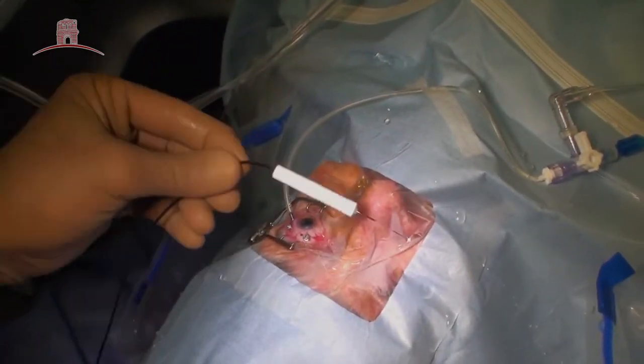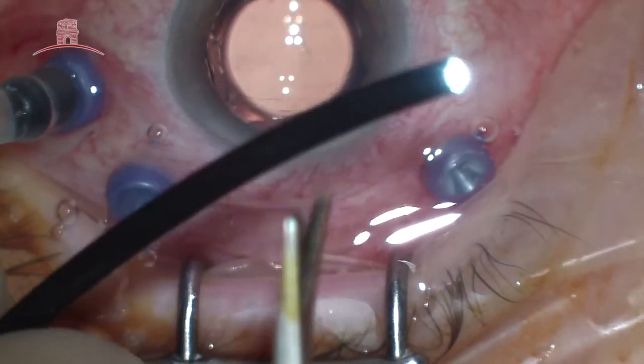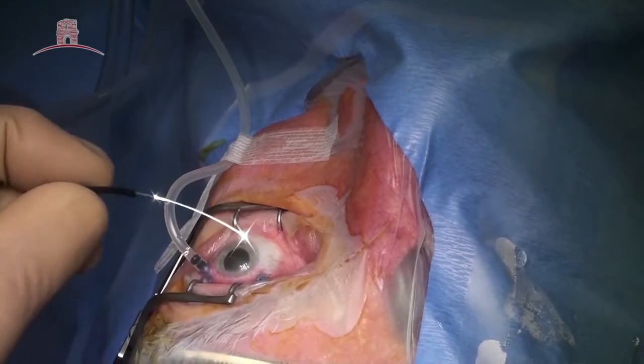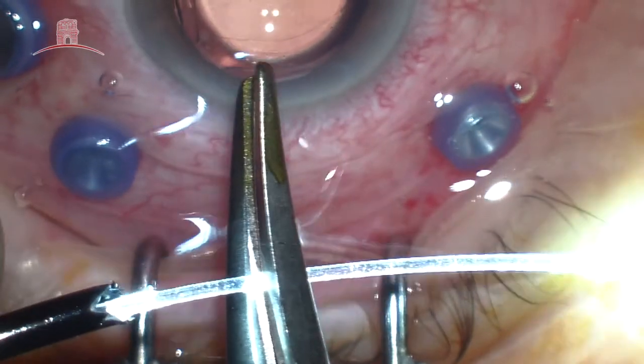The chandelier is easily made. After performing central vitrectomy, the optical fiber cable is modified. The cable is cut and stripped of its plastic coating. It is eventually shortened of about 1 cm. Peripheral vitrectomy is then completed with a contact or a non-contact system.